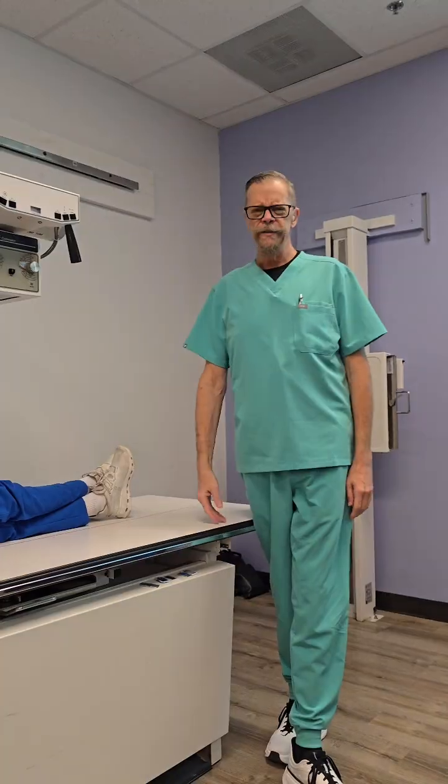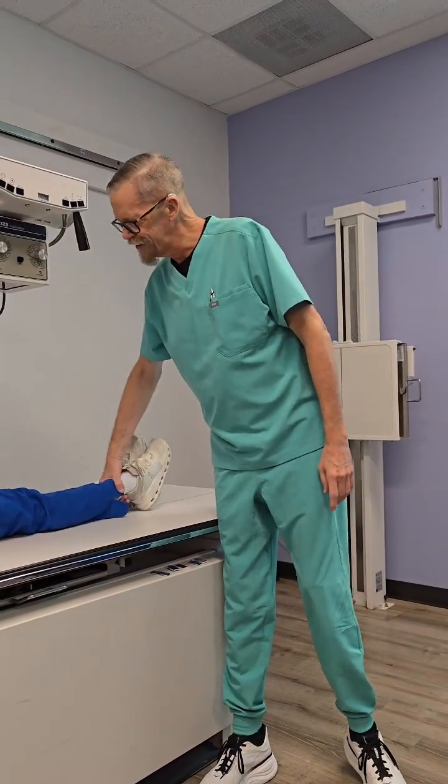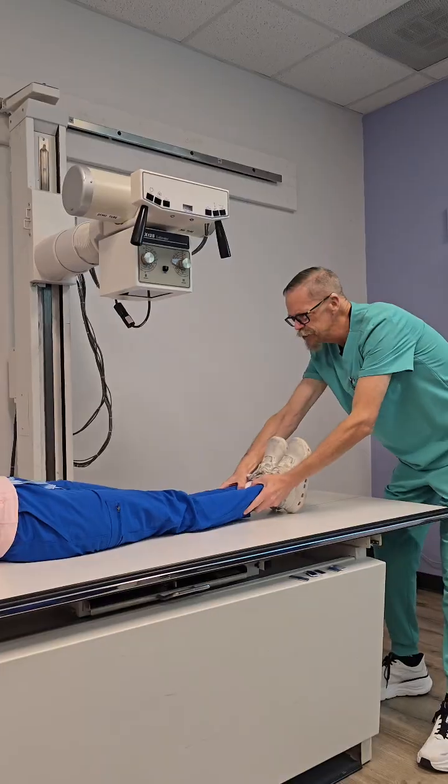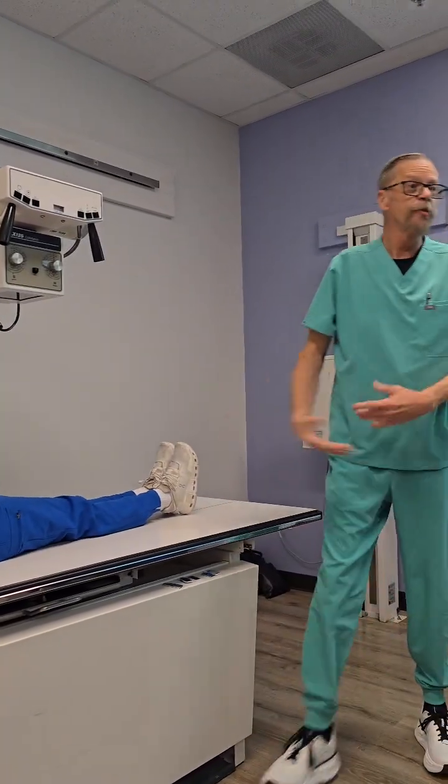Especially when you're doing something lower extremities, you're like, what's your leg was all hurting? Apparently not now. So yeah, we want to uncross their legs. Get them straight on the table. If your patient's really small, you can just literally move them all around however you want.